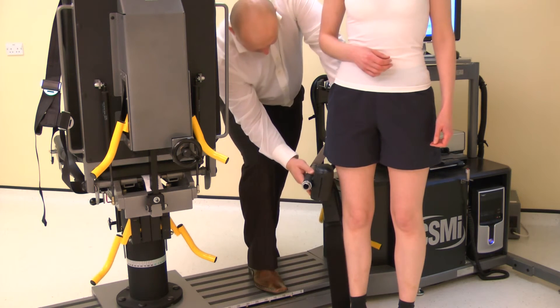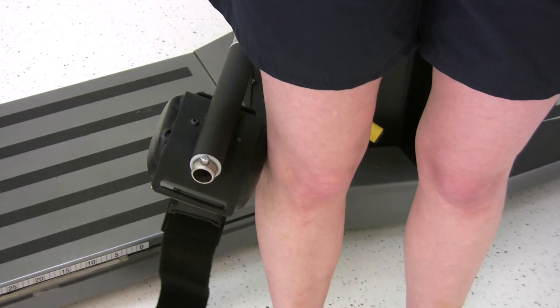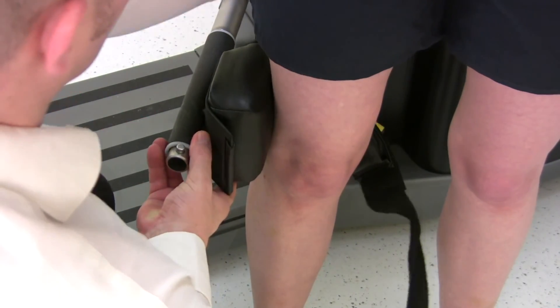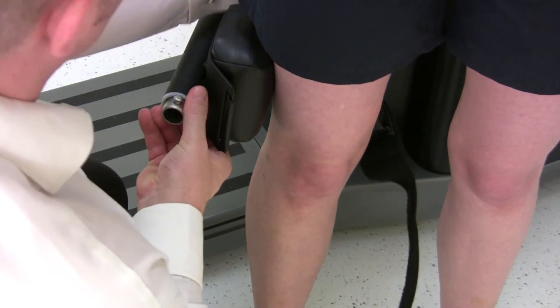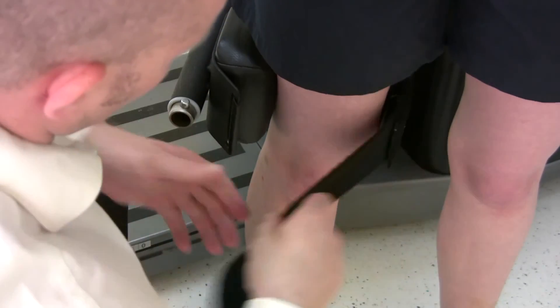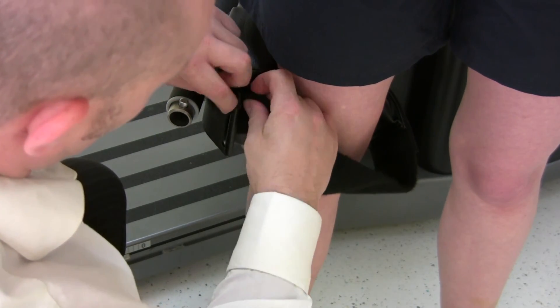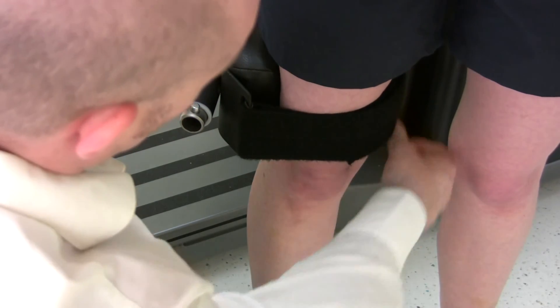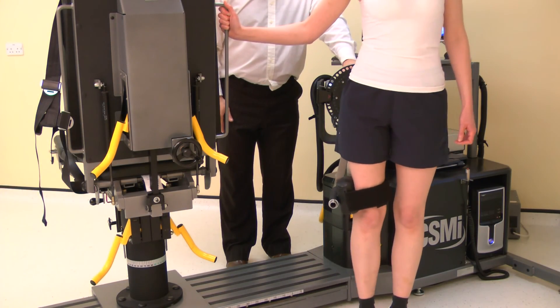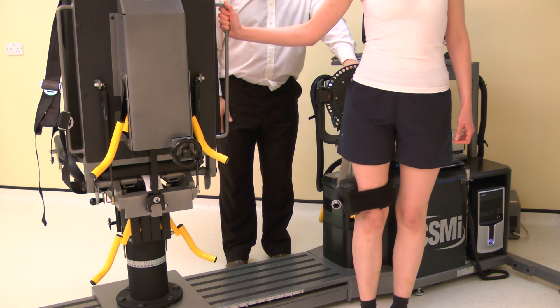Attach the knee hip pad just above the knee. Adjust for length if required by loosening the knee hip adapter. Ensure the strap is firmly affixed. If the knee hip pad moves up and down the leg, the axis of rotation is wrong and needs to be reset.